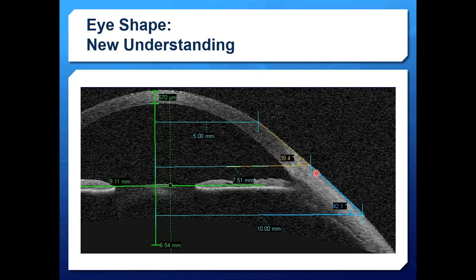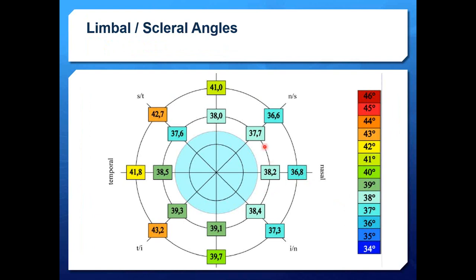Then we also measured the angles that formed from 15 millimeters to 20 millimeters to see how different this angle in cornea and sclera was different from this angle completely on the sclera. And what we learned was at the 15 millimeter diameter, the 15 millimeter chord, the eye has about 1.7 degrees of differential. The eye is fairly symmetrical at 15 millimeters out. At 20 millimeters, this outer annulus, the eye begins to have much more asymmetry. There's 6.6 degrees of asymmetry out there.